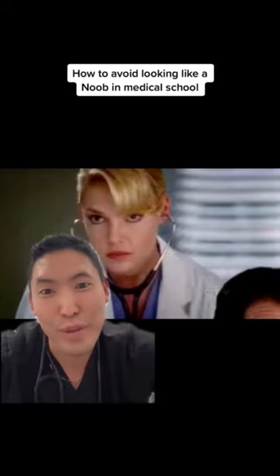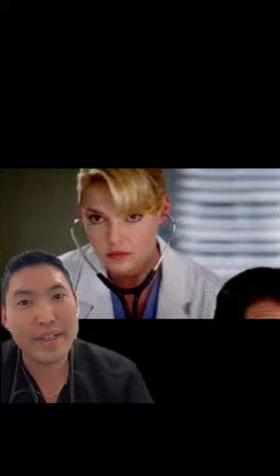How to not look like a noob when you start off in medical school. So you got your first stethoscope and you don't want to be wearing it like this or this. If you look at your stethoscope there's a natural curvature, and you want the earbuds to be facing anteriorly — towards your face, not towards the back.